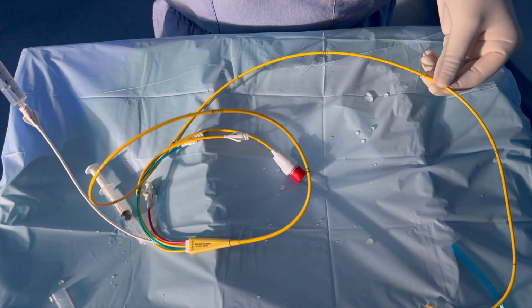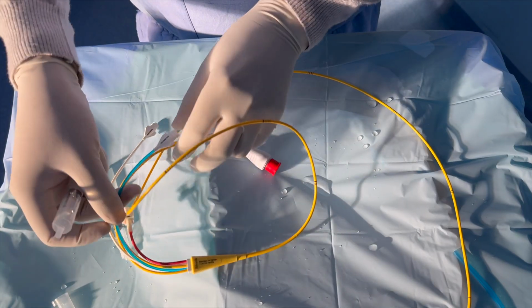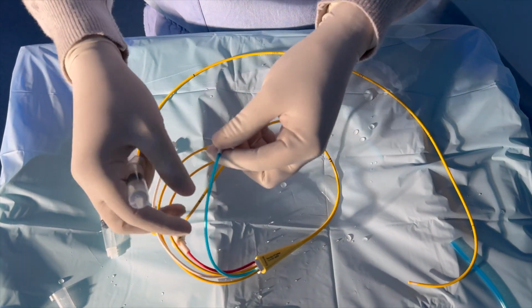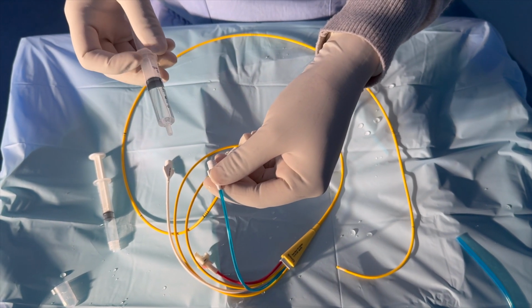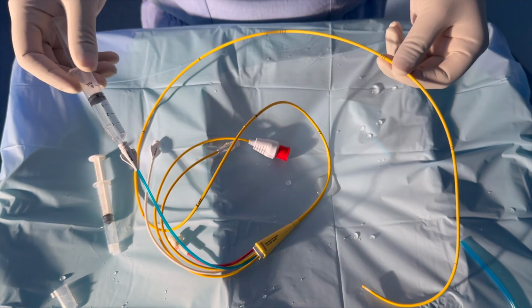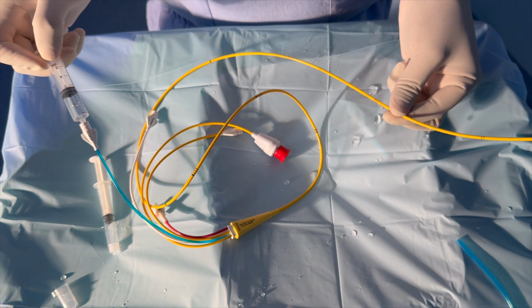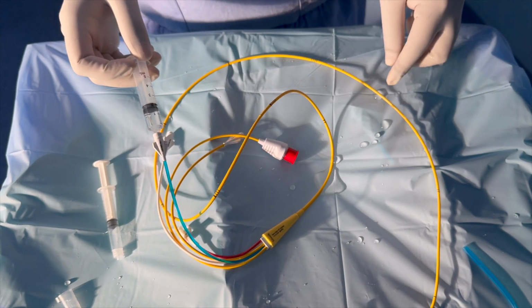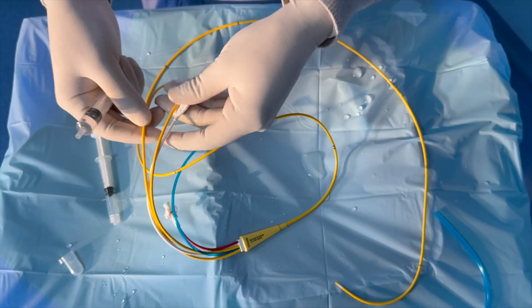Now the next port, here you can see the blue color. The blue color port is used for CVP measurement, and while measuring the cardiac output, you have to push the cold saline through this port. It also opens around the 30 centimeter mark, and its opening lies in the RA when the catheter is inserted.